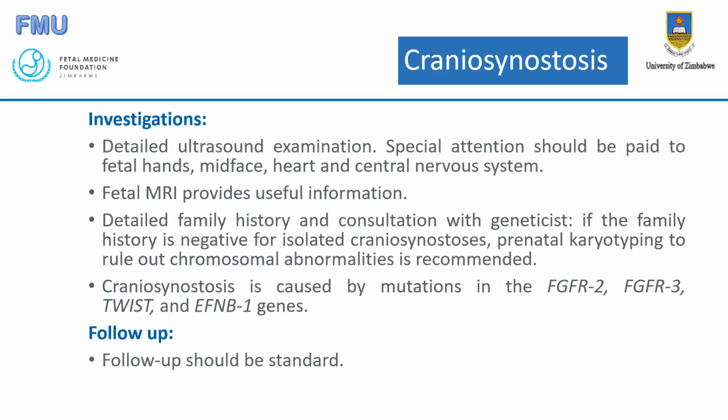Craniosynostosis. So one of the most important parts of scanning a baby with craniosynostosis is to rule out the association, because that will lead us into a syndromic pattern approach. On detailed ultrasound examination, special attention should be paid to the fetal hands, mid-face, heart, and also central nervous system as part of the syndromic pattern workup.